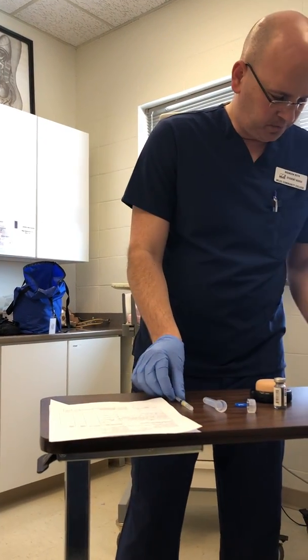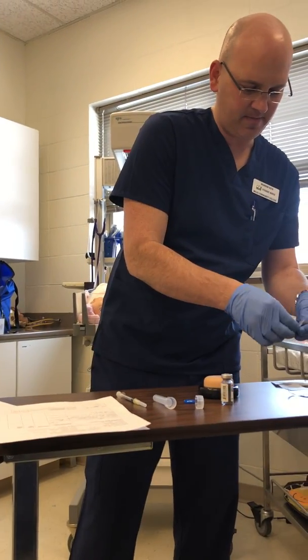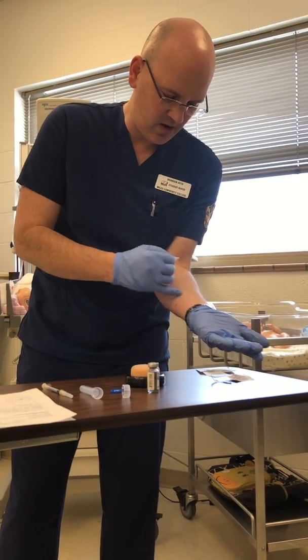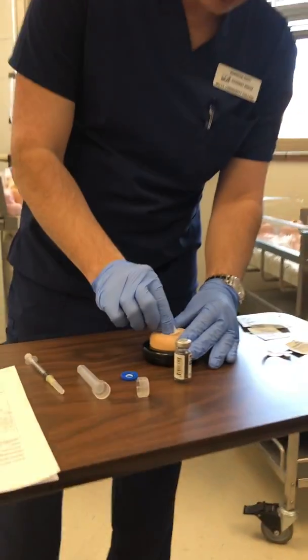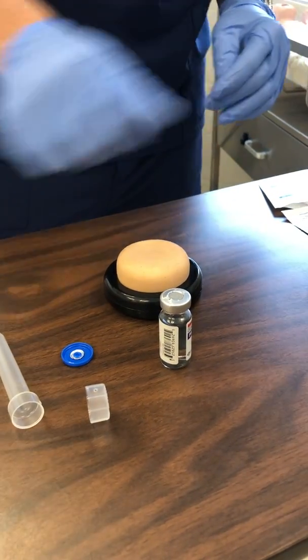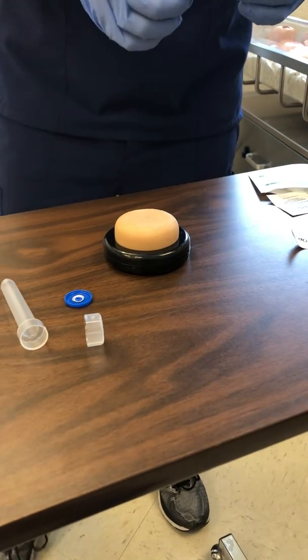I'm going to take a sterile alcohol swab, and I'm going to ask Skip for his forearm underneath here, and I'm going to clean starting in the center in a circular motion, working my way out. We're going to allow for the skin to dry.